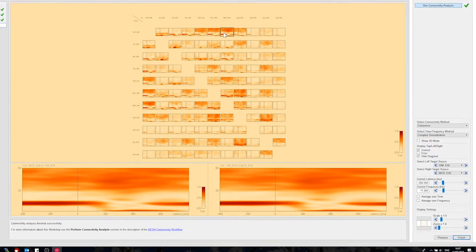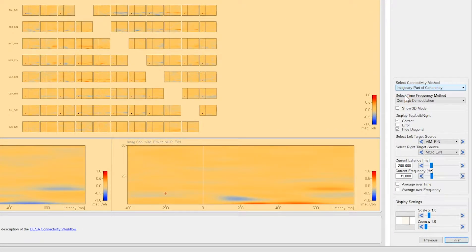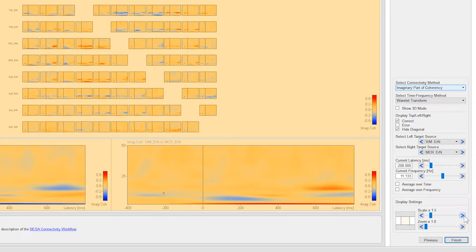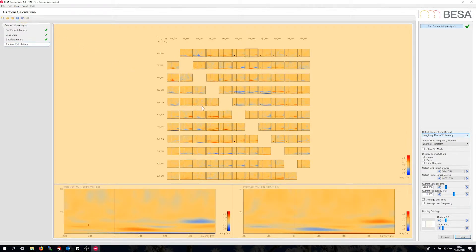So let's go to imaginary part of coherency and switch to wavelets. I'm going to scale up a bit, and also improve the display for checking out the matrix. Switch off the information window at the bottom and zoom the whole display.